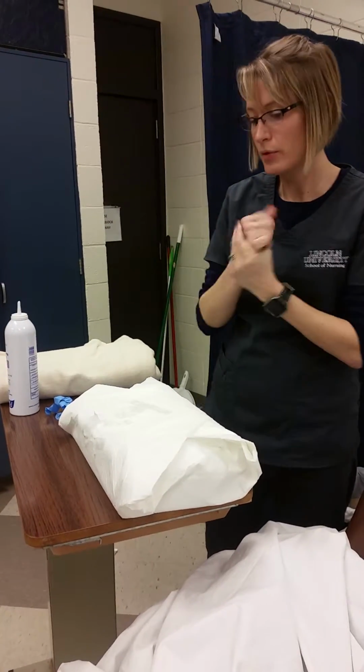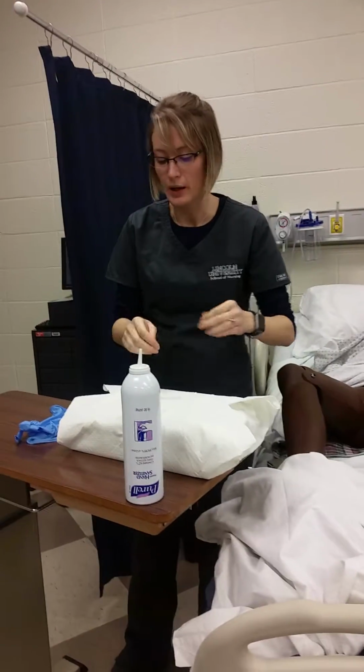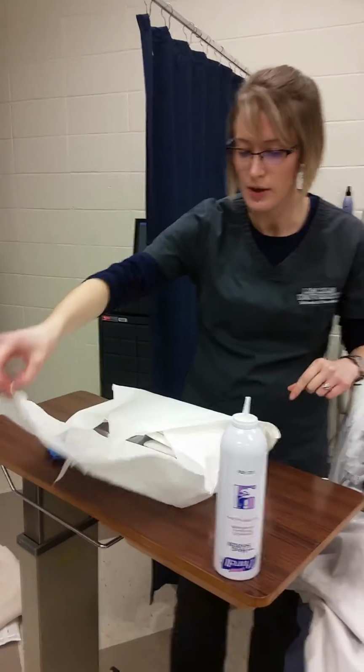Wash my hands. I'm going to go ahead and get rid of my bath blanket, so I'm going to go ahead and wash my hands again one more time, just to be sure. And then I'm going to go ahead and open my Foley catheter kit. So I'm going to open it farthest away from me first, only touching the outside flange perimeter.